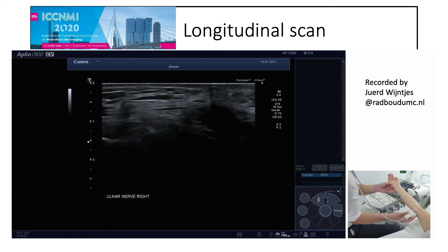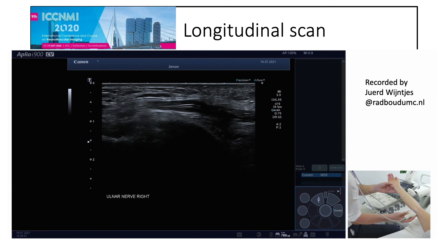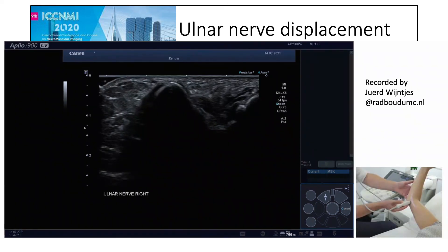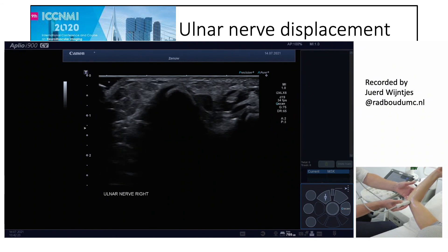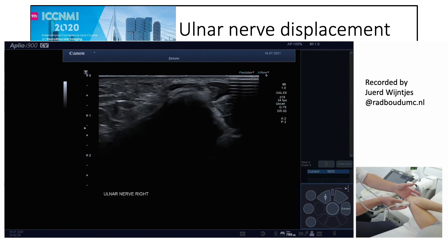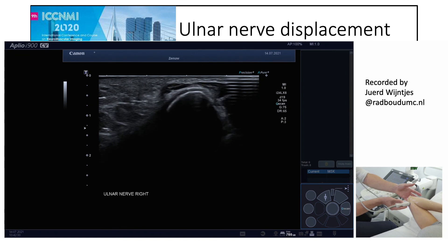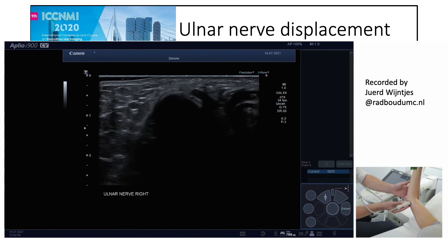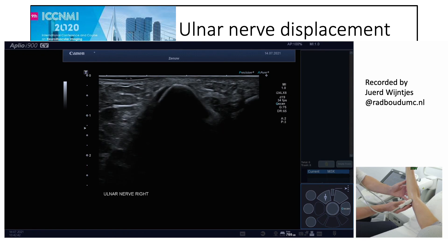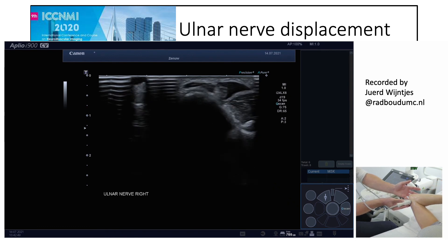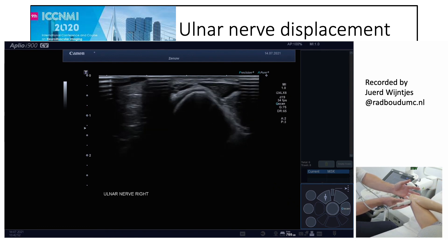By convention, proximal is on the left and distal is on the right. The last thing to demonstrate is displacement of the ulnar nerve. We see the ulnar nerve at the medial epicondyle deep down, and when the patient flexes the elbow, the nerve jumps over — this is complete dislocation of the ulnar nerve at the elbow. In the physiological resting position it is in place, but with complete flexion it just jumps over.